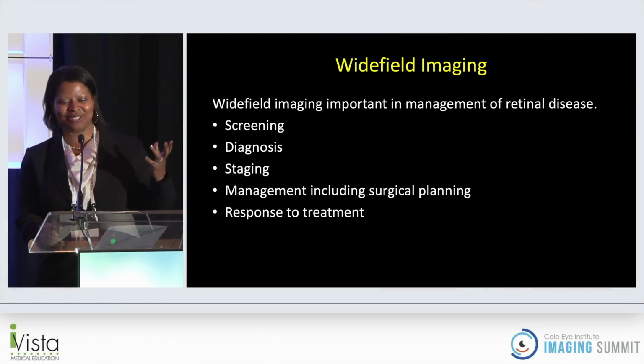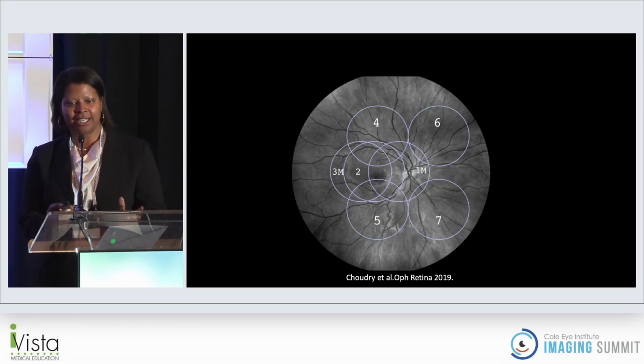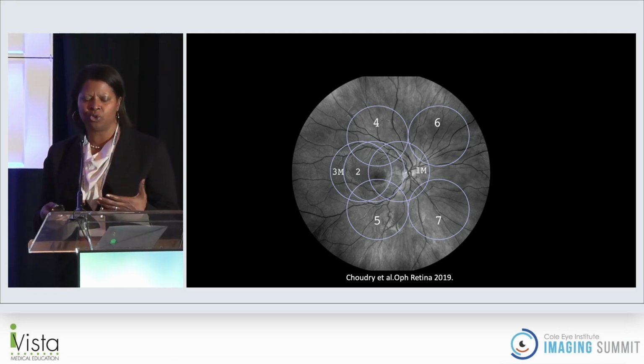So wide field imaging is really important for management of retinal disease, screening, diagnosis, staging, management including surgical planning, as we heard earlier, and also assessing response to treatment. And as Vas just elegantly showed, this was a working group that really tried to help us with our terminology. What's standard field? What's wide field? What's ultra wide field? And you can see the different ETDRS 7 fields outlined there.